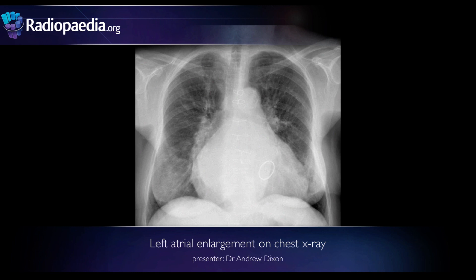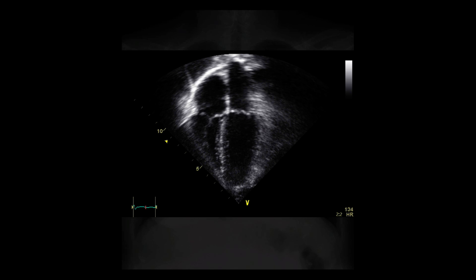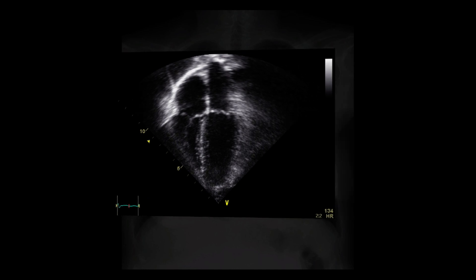In this radiology tutorial, we are going to learn how to recognise left atrial enlargement on chest radiographs. While assessment of cardiac chamber size and function is most practically assessed with echocardiography, the sheer number of chest x-rays performed means that it remains important to be able to confidently identify left atrial enlargement on radiography.